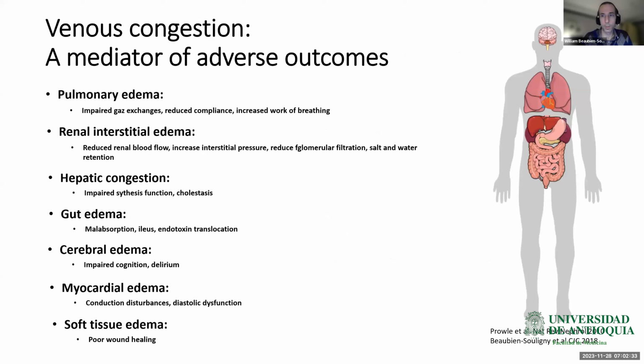Afterward, we performed a second study, now including 145 cardiac surgery patients, with the objective to assess the relationship between abnormal portal vein and intrarenal venous Doppler and complications, more specifically in this study, acute kidney injury. In this study, ultrasound assessments were performed before surgery and post-op daily until post-op day 3.